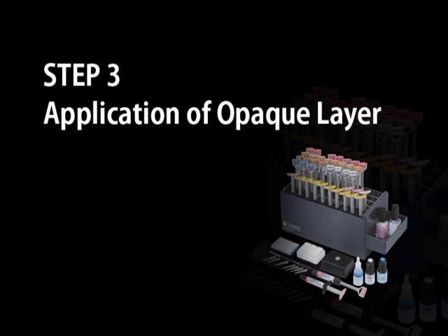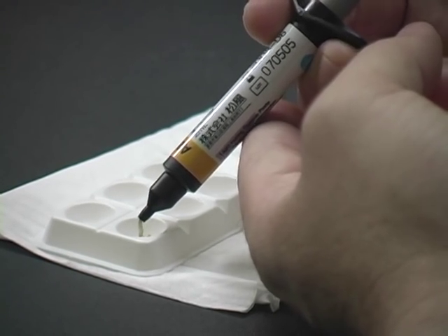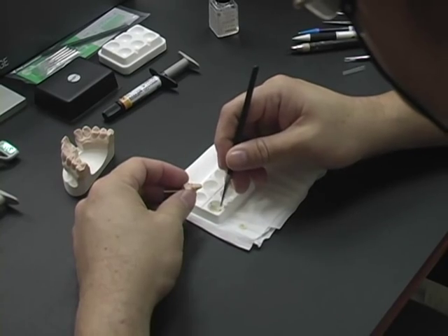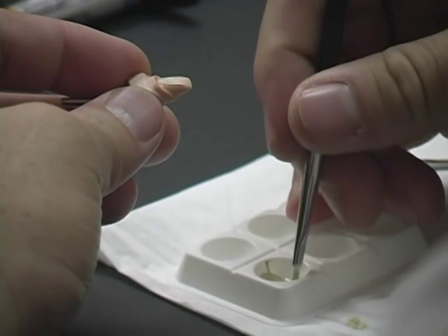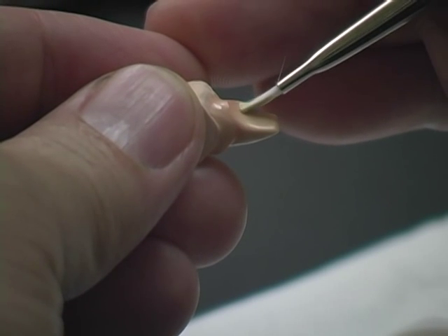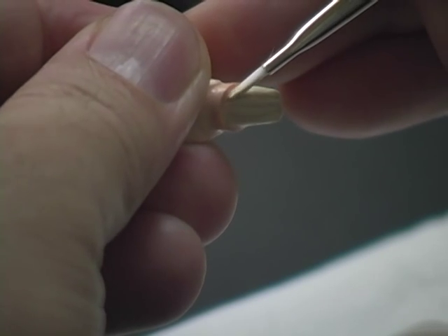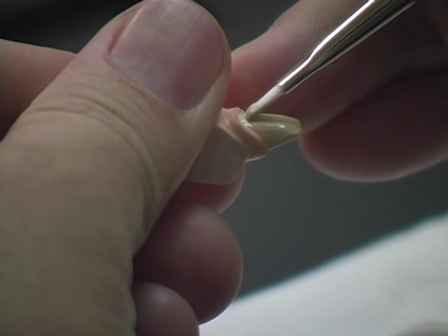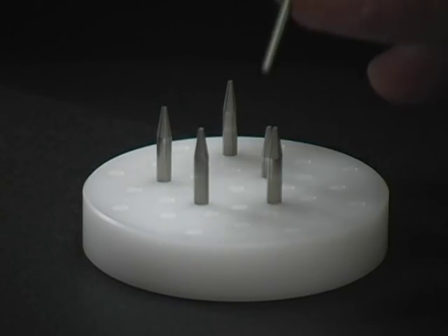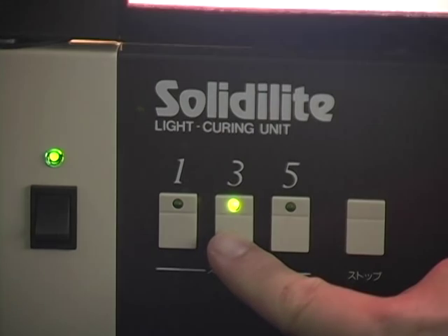Application of opaque layer. Dispense the Ceramage Flow Opaque A2O into the mixing dish, then apply a thin, even layer using a brush to cover the entire surface completely. Do not apply the opaque on the margin area. Place the die on the tray and light cure in the Solidilite curing unit for 3 minutes. The 1-3-5 buttons indicate the curing times available, and the rotating platform ensures uniform cure to enhance physical properties.